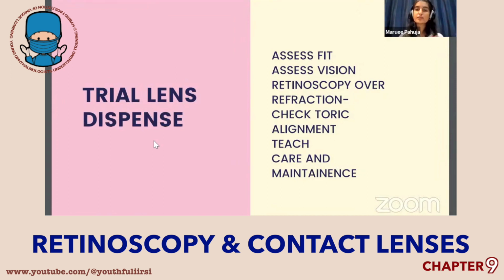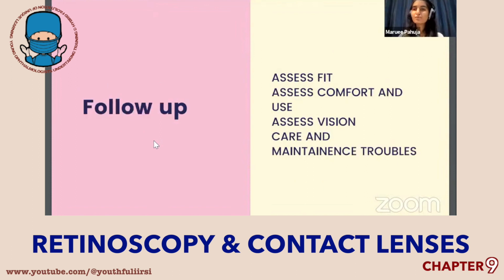Care is a very, very important and crucial step in ensuring there are no dropouts with contact lenses, and it is an added advantage when the patient comes to a clinic versus an optical store. These steps are usually just missed, and most patients do not know how to take care of the contact lenses and therefore land up with a lot of complications and end up in the ophthalmologist's clinic. So we want to avoid that and make sure that patients have healthy eyes with contact lenses.